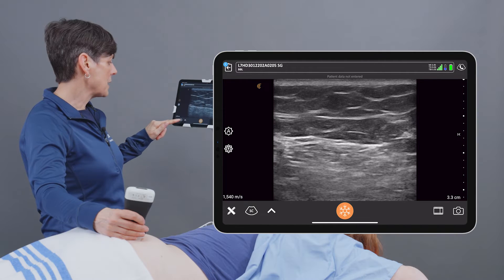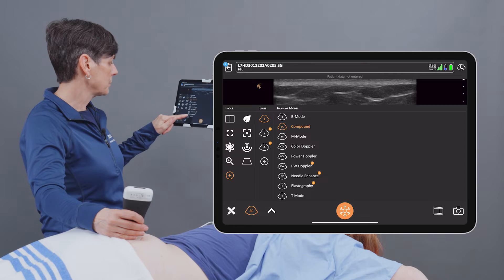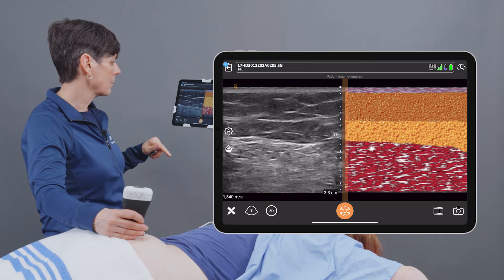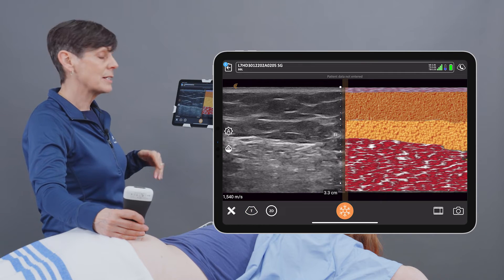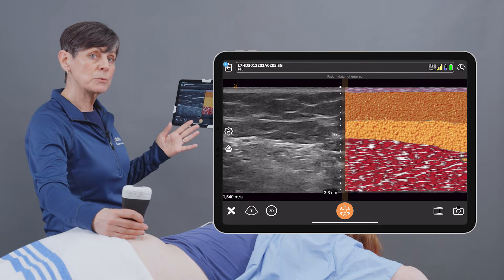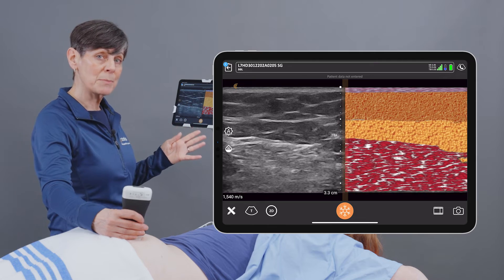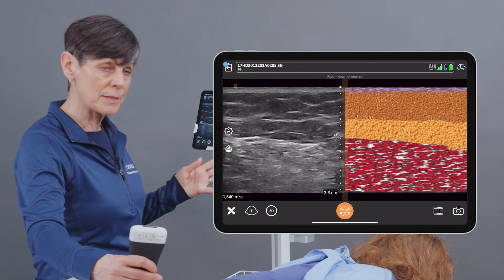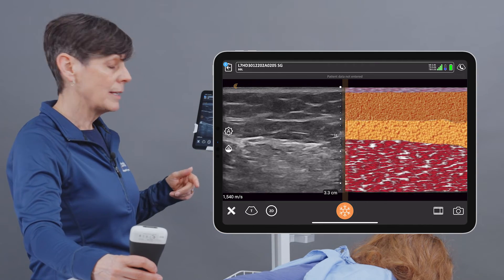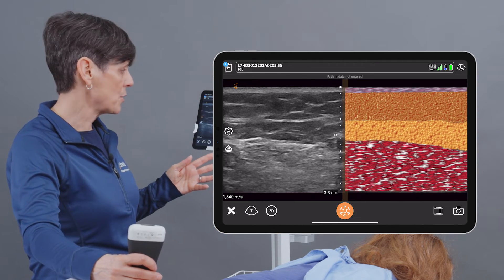And then we can activate T-Mode under the Modes menu. You're going to see a side-by-side graphical representation of different tissue types and tissue layers, and this is all displayed in real time as you scan.